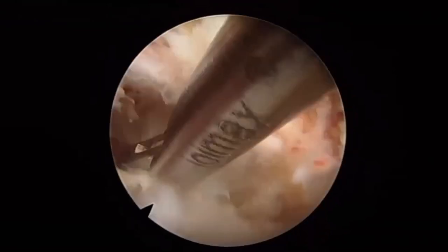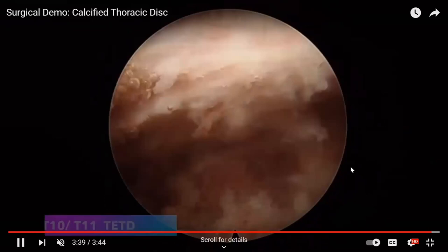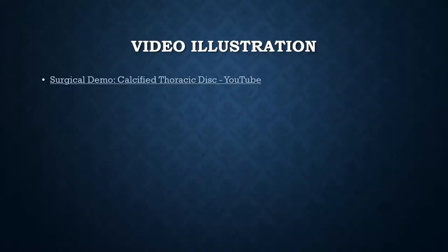And you see all these instruments, some of them are more curved than others. Your endoscope also has an angle. It's going to be between 20 to 35 degrees, depending on what scope and what company you're using. So I thought this is just a great video to showcase the specifics of this procedure.